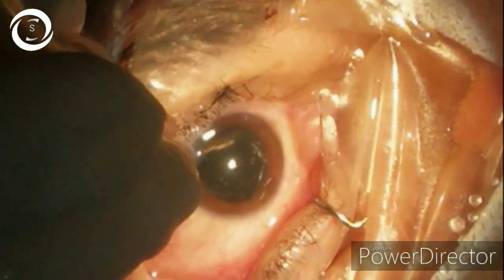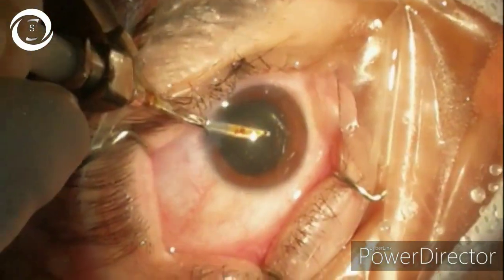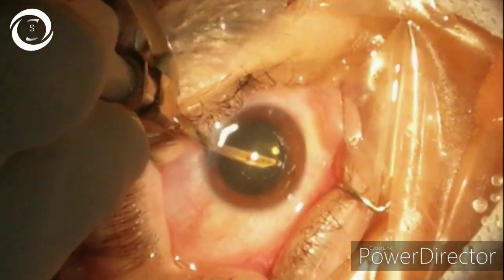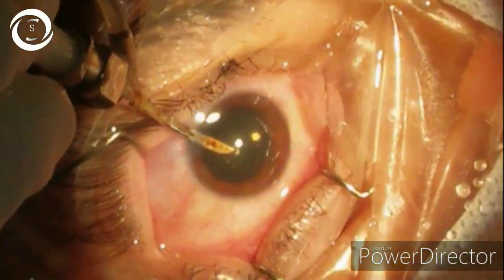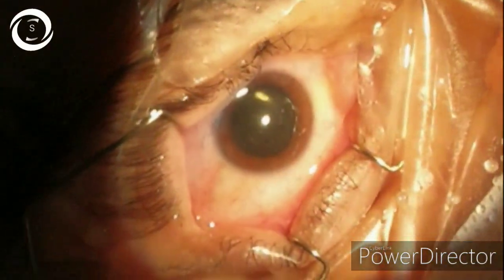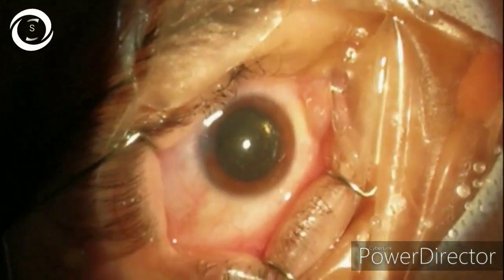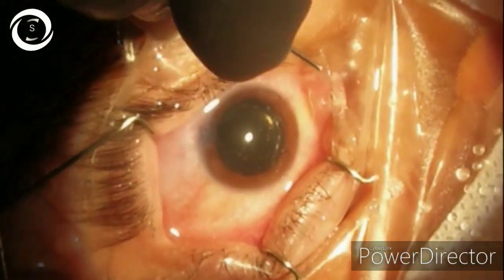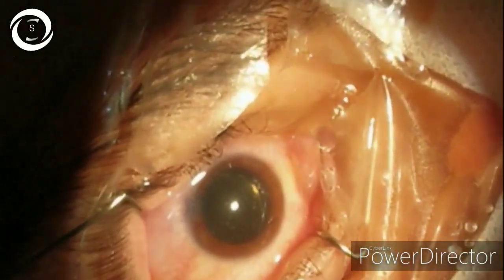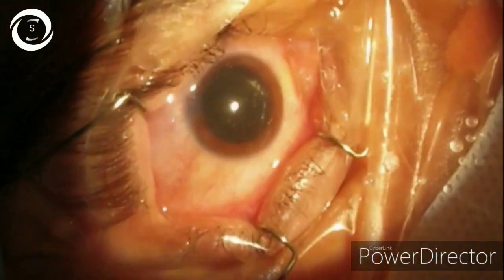In conclusion, very high myopes are very happy patients after correct cataract surgery because they live with such high numbers — minus 8, minus 10, minus 12 — and even if there is a little refractive surprise post-op, they happily accept that. They are extremely happy patients after cataract surgery. But you should know how to perform clear lens extraction and how to avoid post-op retinal detachment and other complications. That was all about the clear lens extraction — I hope you have learned something. Thank you very much.